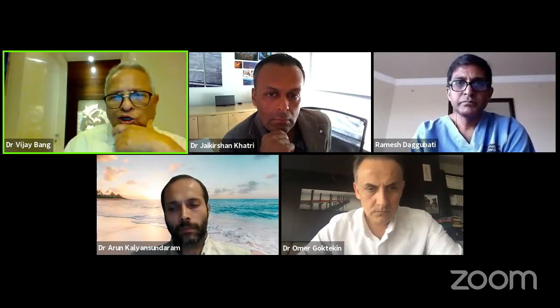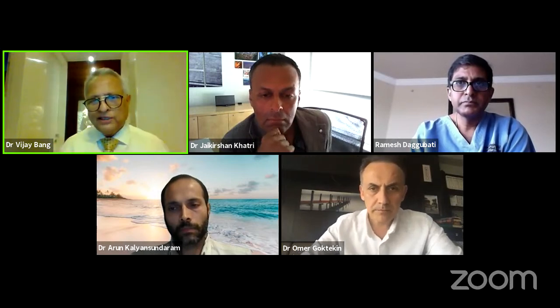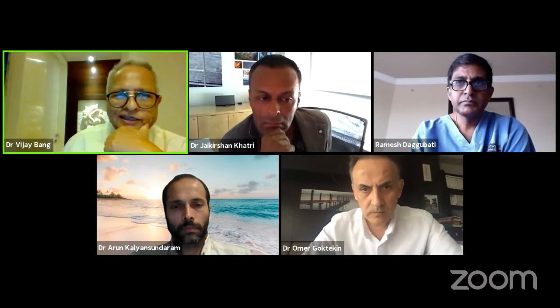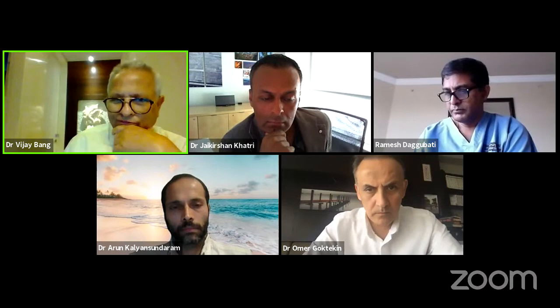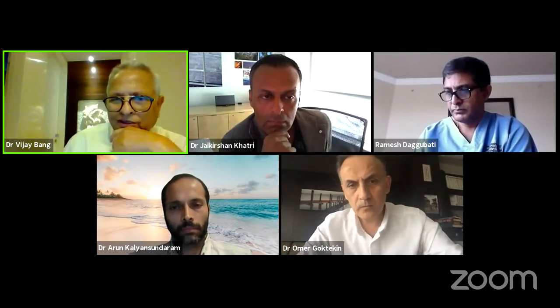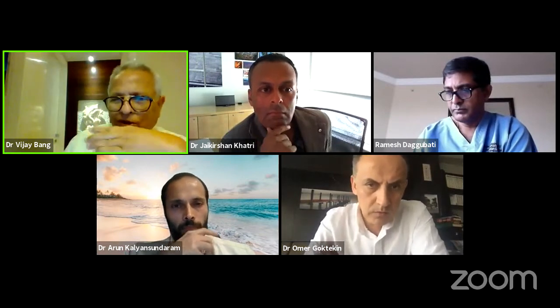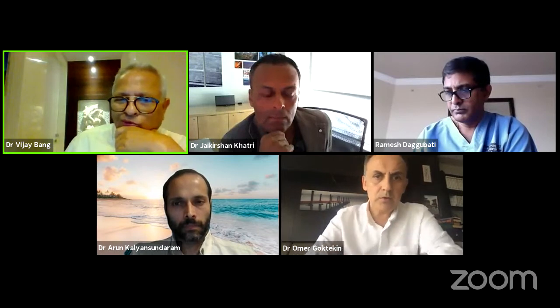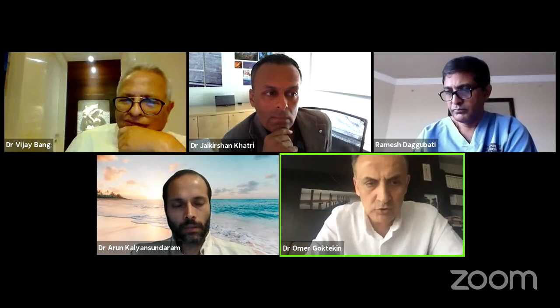I would like to know from Omar also about this fluoro time, because it is now catching up in the CTO program very seriously, that we need to cut down the fluoro time. We employ all those techniques, reducing frame rate, all those things. But is there a particular gray number that if it is exceeded, you don't want to continue the case? Mostly we look not for duration. We mostly look for gray, and our limit is 5 gray.